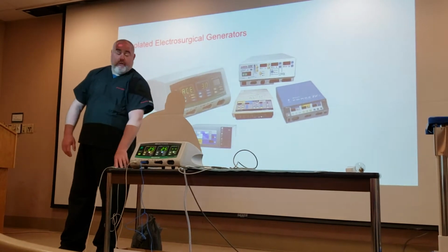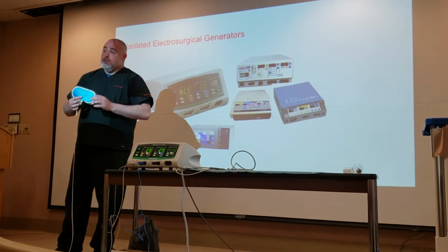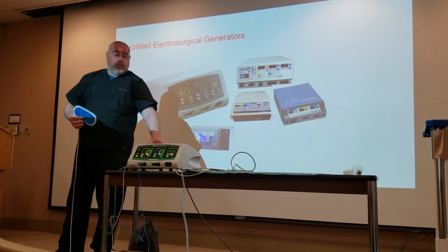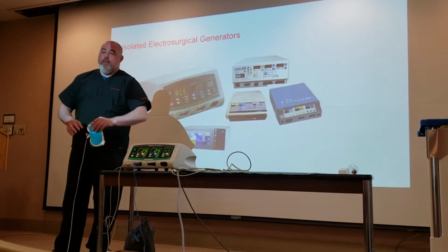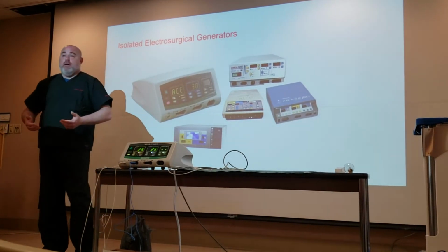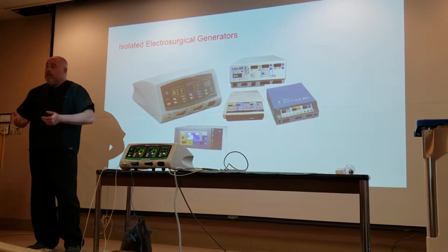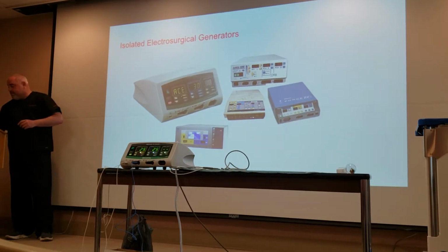And the proper name for these are actually return pads, not grounding pads, because we're returning the electricity back to this generator, which is essentially a transformer. That's what's happening here. It is transforming the electric current and how it works. But a big safety improvement because you had alternate site burns and other issues regarding a lot of things with those generators.